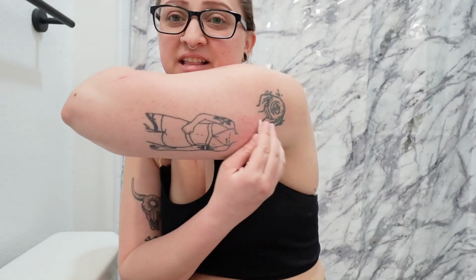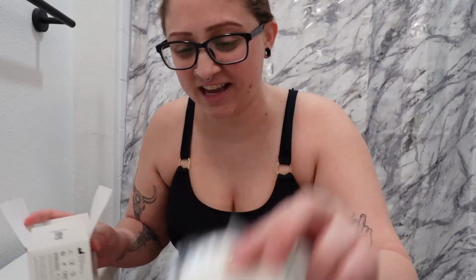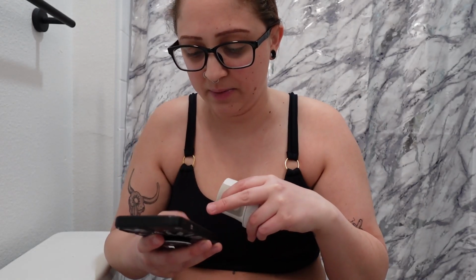All right, let's go ahead and clean the heck out of this. Okay, we're gonna go ahead and clean the other side now because I cleaned the first one. I literally just cleaned the entire span of my arm so that I can make my life easier. We have the Dexcom patch, over patch, and then the Libre over patch. Perfection. Okay, so I'm gonna go ahead and keep the box to the side and let's start her up.